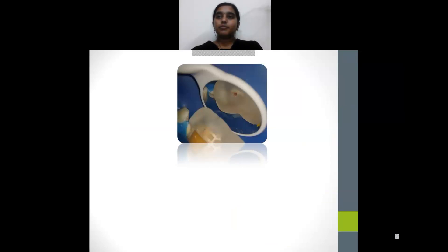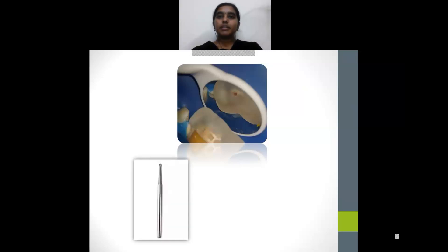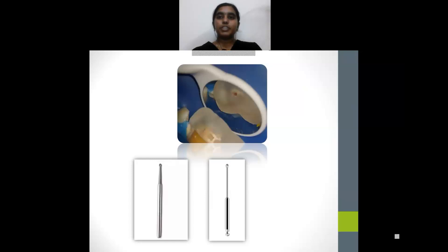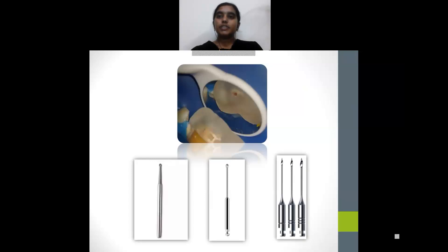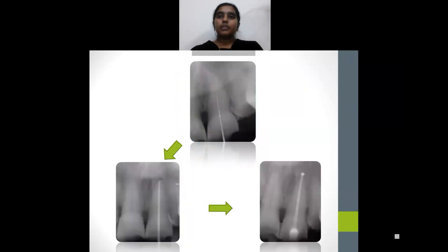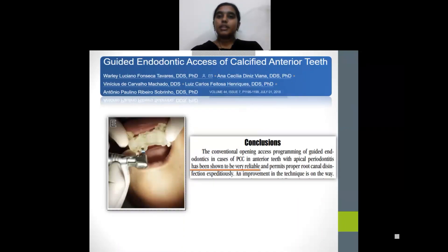The template is removed from the tooth surface and initial entry into the enamel and dentine was done using a high-speed air rotor with a quarter-sized round bur. Once penetration into the dentine was obtained, the template was placed back and an Endo bur was used to its full length, followed by the use of K-files. The negotiation of the canal was done in 10 minutes. Cleaning and shaping was done with rotary NiTi files and obturation was done using cold lateral compaction technique. It was concluded that guided endodontics in cases of canal calcification was more reliable and preserved root canal structure.